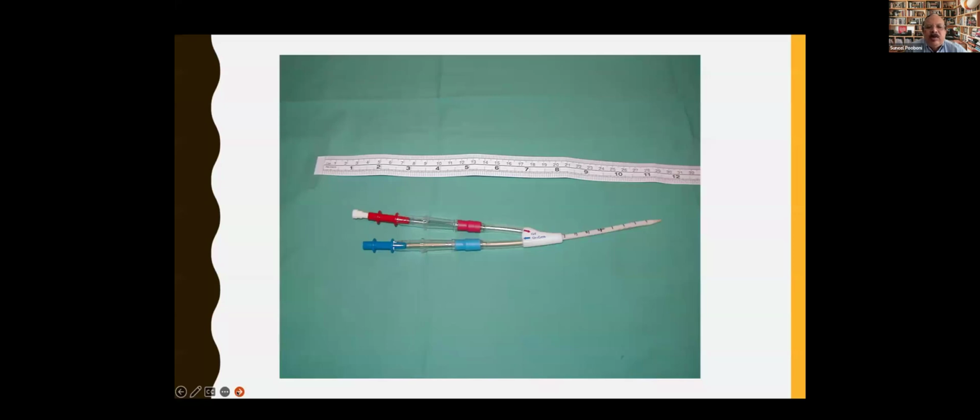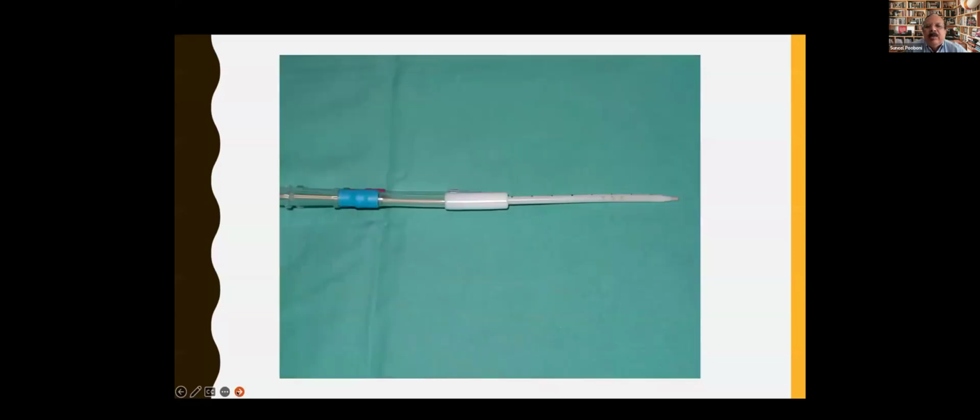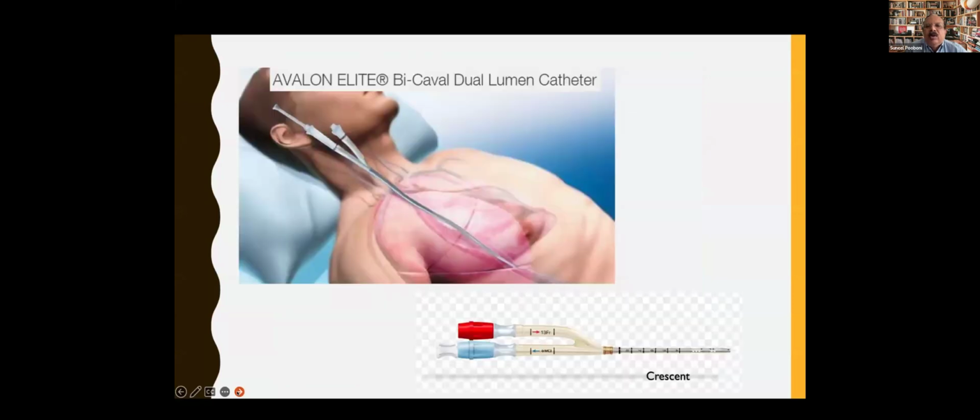So some of the photographs of cannula, a WMN cannula being seen here with side holes and 2 additional cannula.